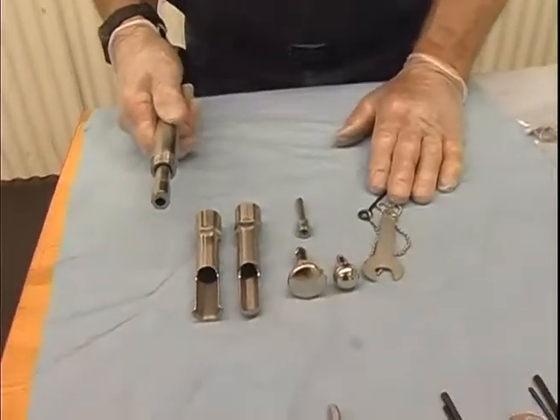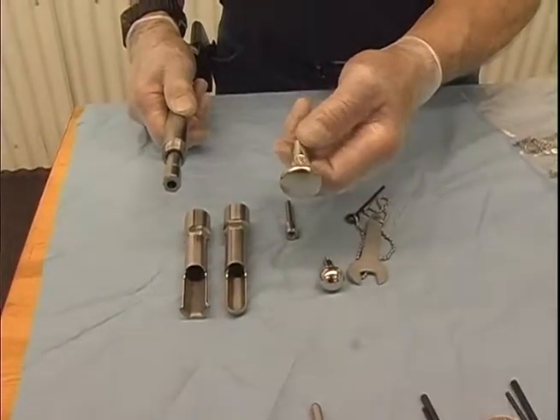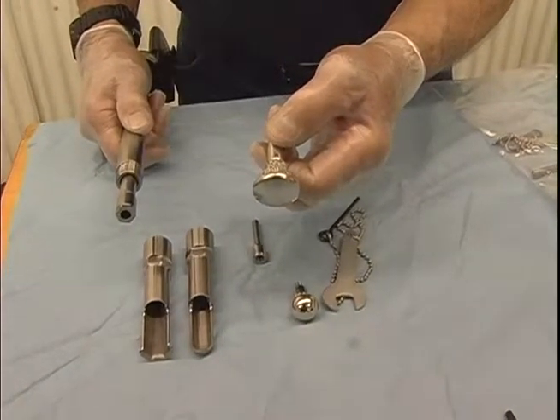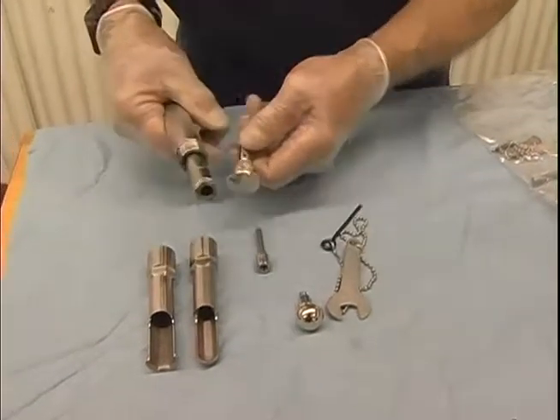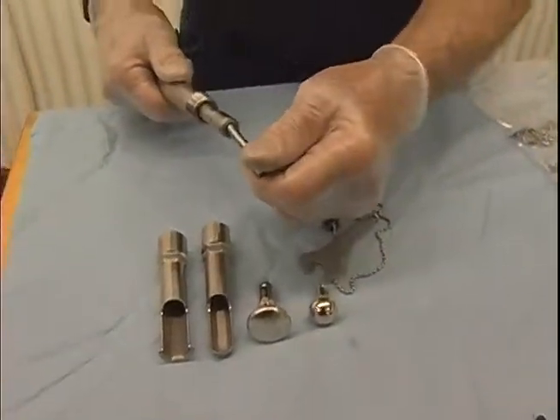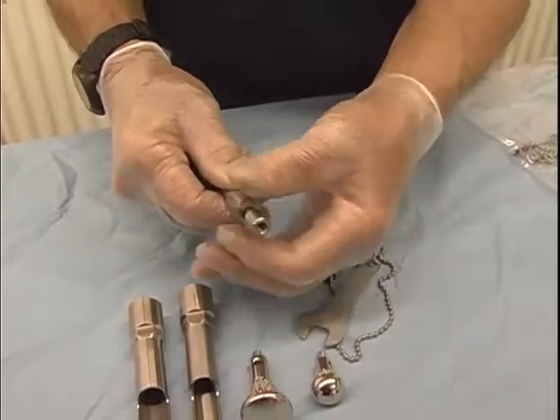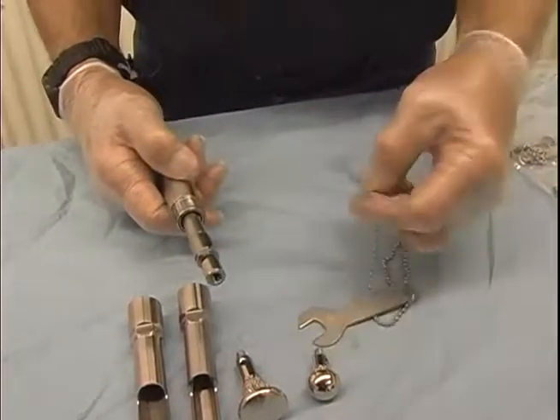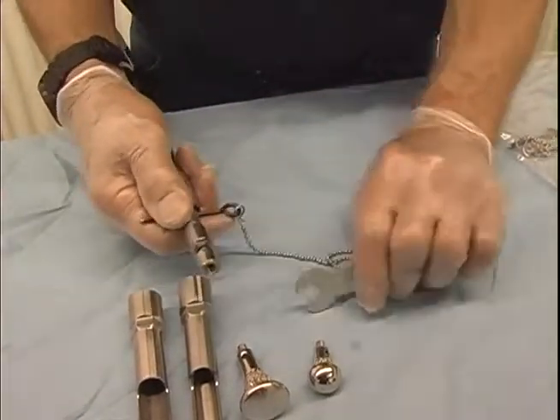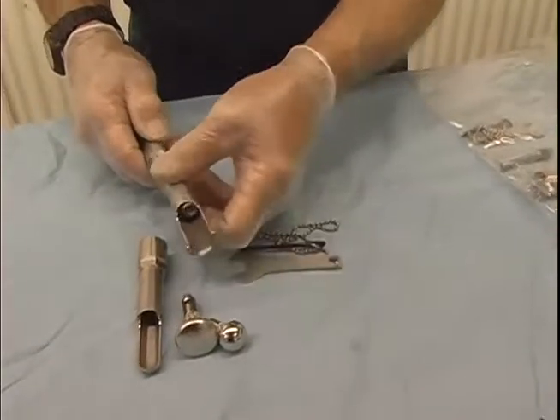Once on, we have a variety of things that we can do. This particular burr is called the upper 11 burr, and it is to burr the back edge, the caudal edge of the last upper cheek tooth, the hook on the last upper cheek tooth. And it's assembled with this guard. So the way this is assembled is, first of all, this attachment goes in and is tightened. It's tightened by putting this pin through the hole, and the wrench is used to tighten this attachment to the collet. The next thing that happens is this open end guard is put on.